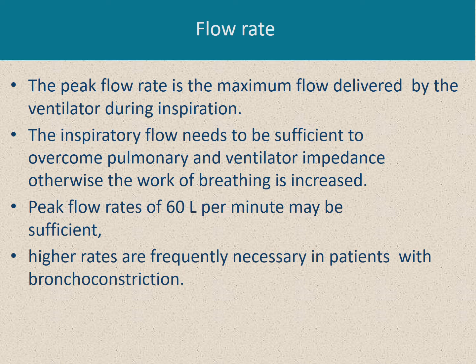After setting the previous parameters, we will set the flow rate. The flow rate or the peak flow rate is the maximum flow of air or the speed of air delivered by the ventilator during inspiration. The inspiratory flow needs to be sufficient to overcome pulmonary and ventilator impedance. Otherwise, the work of breathing is increased.